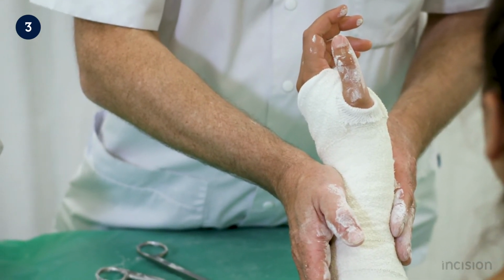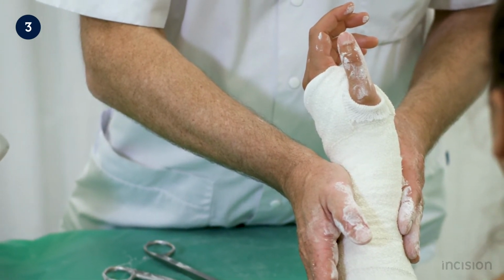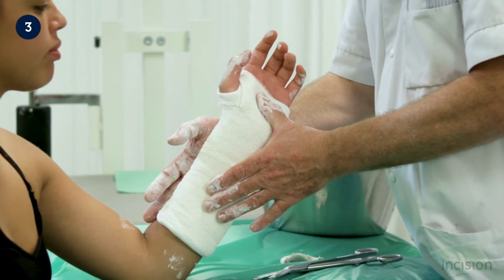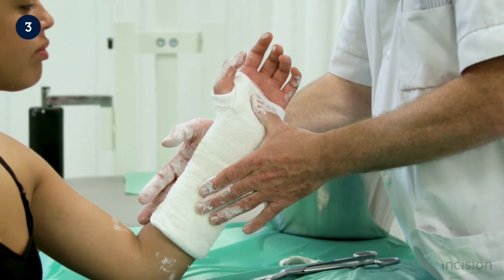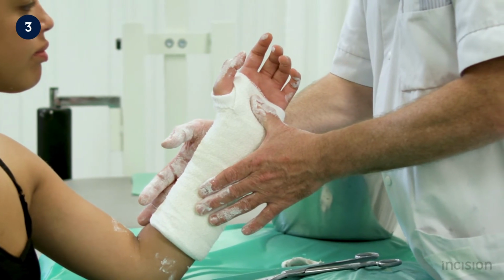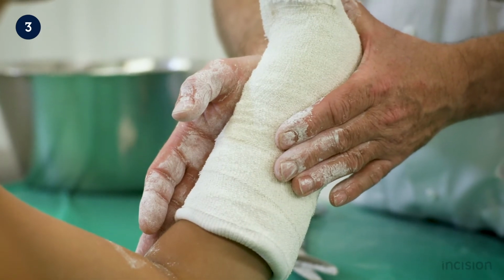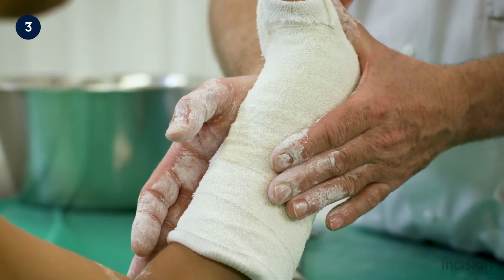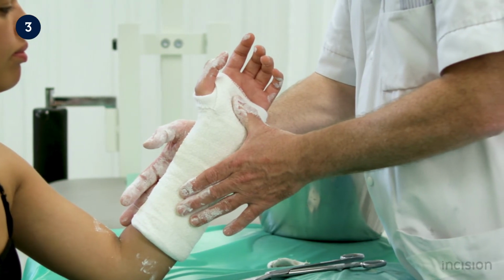The plaster is supported in this position until it is sufficiently hardened. To avoid points of pressure, care is taken to use the flat parts of the hand rather than the fingertips. If there is a Colles fracture, where the distal part of the radius is displaced to the dorsal side, 3-point fixation is placed in an opposite way as is shown in the film Short Forearm Cast.